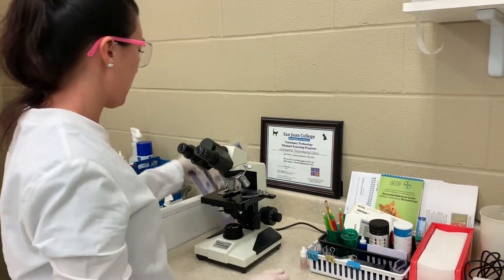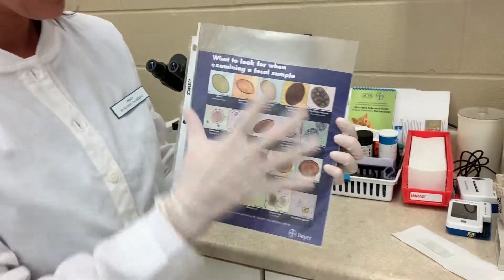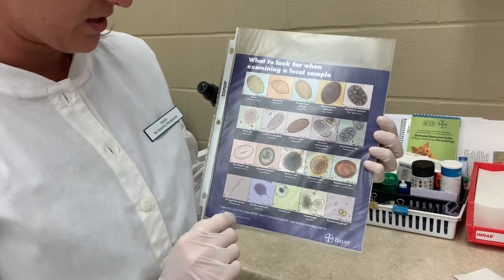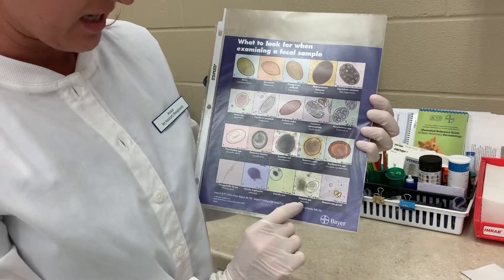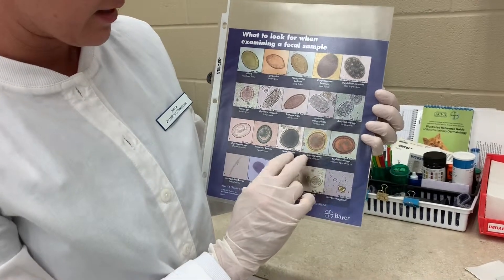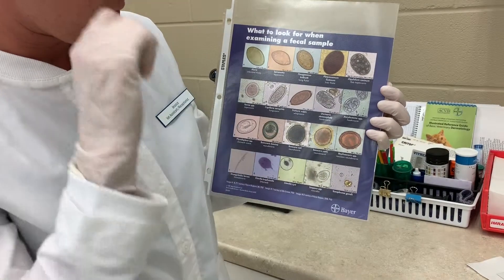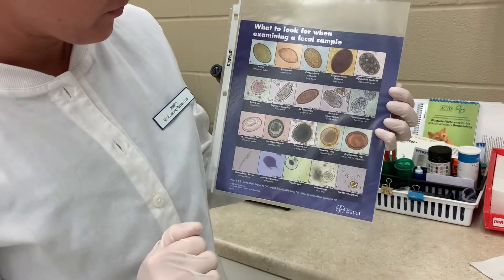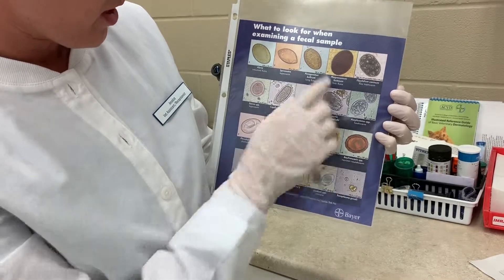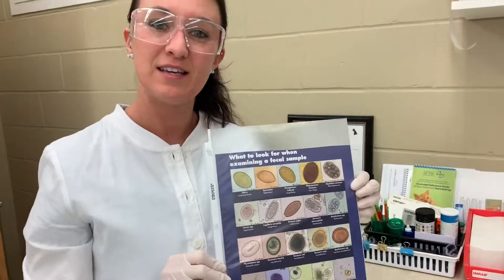The last thing I want to talk about are some common parasites that you might see in a fecal. This is a really good representation of a lot of parasites. Some of the more common ones are Giardia, Isospora which is coccidia, Toxocara canis and cati which is the cat and dog roundworm. You also have hookworms, roundworms, and tapeworms. And this completes the task.